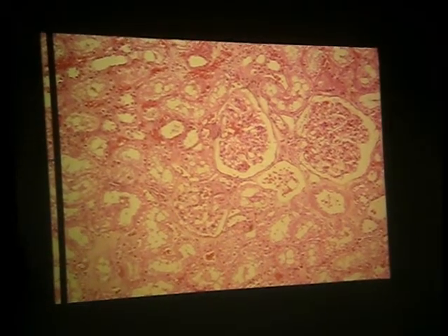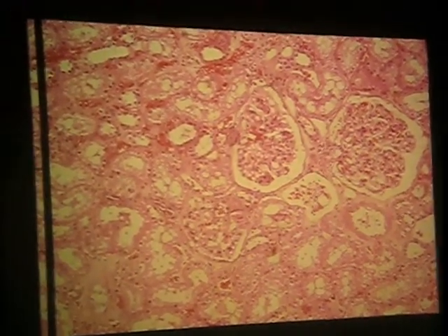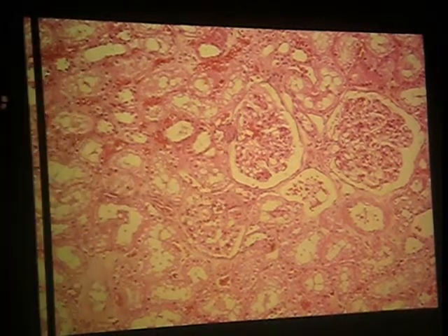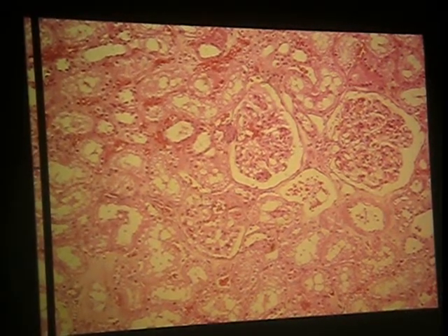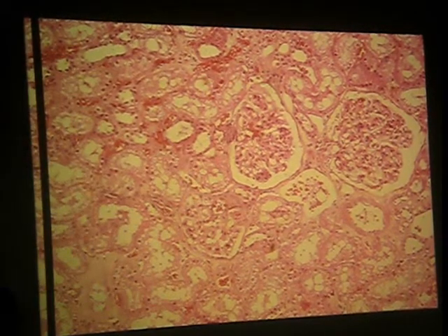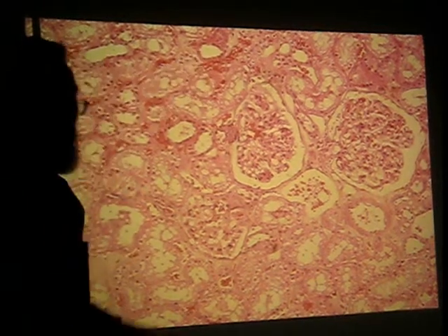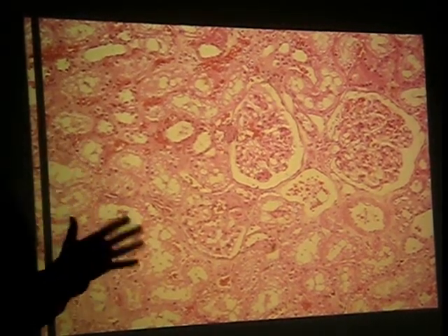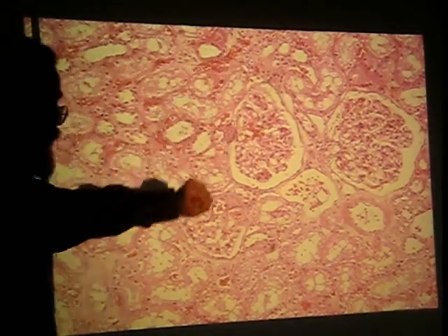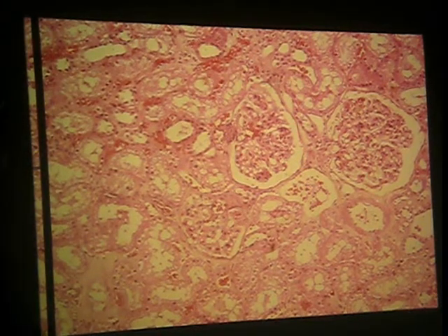All right. Renal corpuscle. And we can see a variety of tubules around here. Most look like they are proximal convoluted tubules, because they're kind of ragged, not very well fixed. That's kind of a clean border. That's clean, so that's probably distal convoluted tubule. Don't sweat that. Just realize why it's a smooth luminal profile. Don't have a lot of microvilli. When they look ragged and they're poorly fixed, it probably suggests they're microvilli.